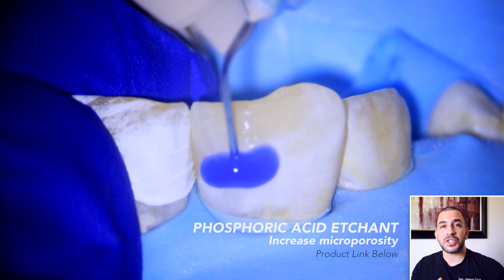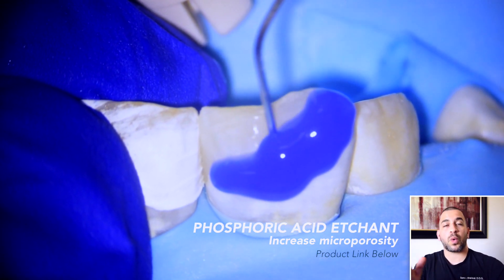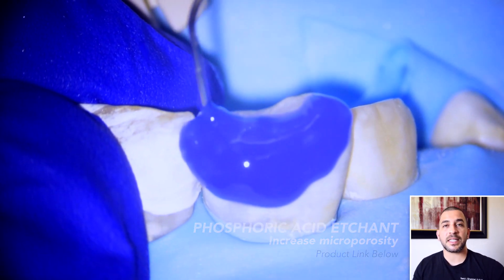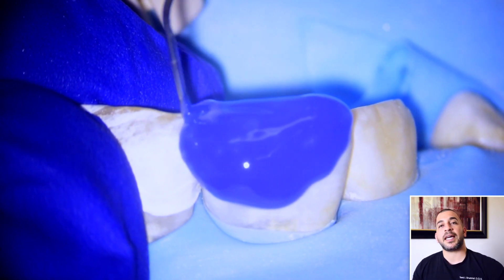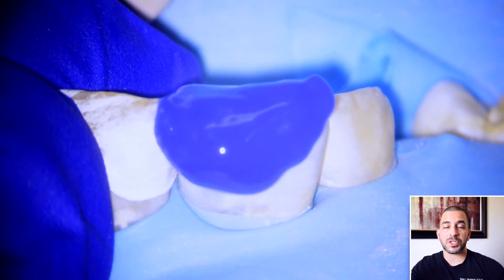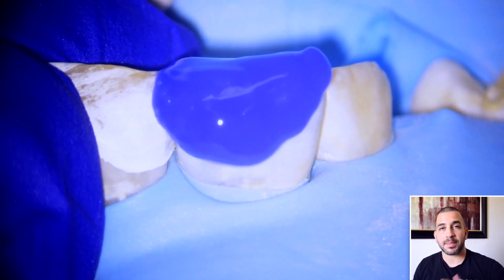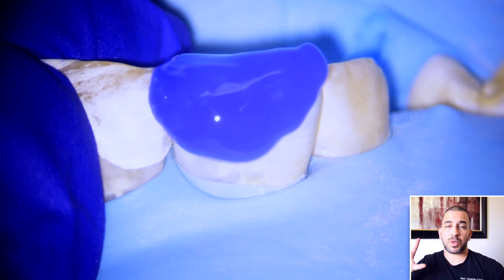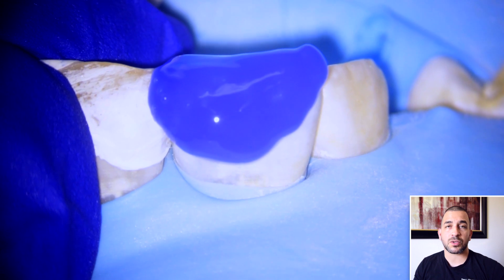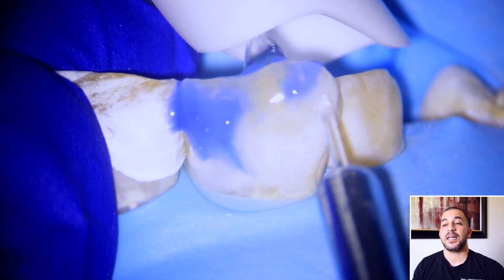When I apply the phosphoric acid etchant, I do start beyond the prepared tooth structure and then work my way towards where the chip is or towards where the dentin is. I don't like to start where the dentin is because it is a caustic material and it can cause sensitivity. So my protocol is always to start beyond the margin of the prepared tooth and then work my way towards the middle or towards the chip surface. Of course hit the lingual surface of the tooth because you want that bonding to wrap around the entire tooth, and then give it about 15 seconds or so. If you're in very superficial enamel you can give it 20 to 25 seconds.